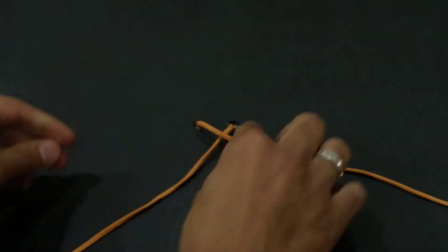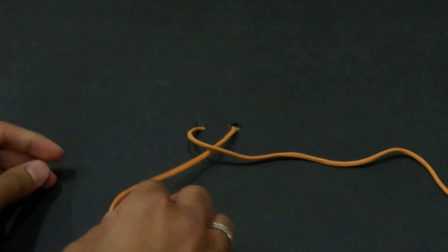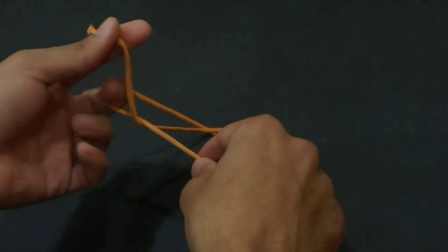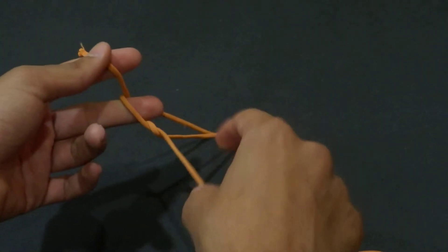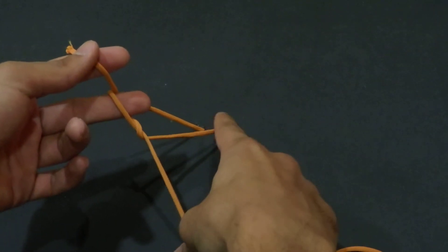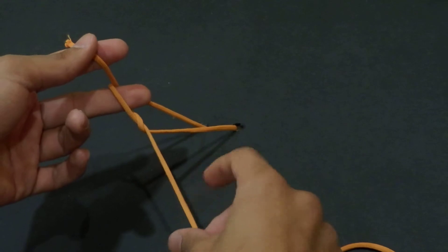And let's do it if it is crossing behind. Crossing behind means I will start by the middle finger, and I have done my first knot. Before I go out, I will use this fixed thread as the second part for my knot.